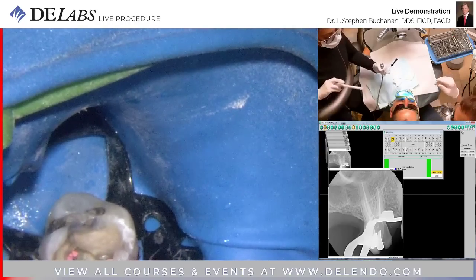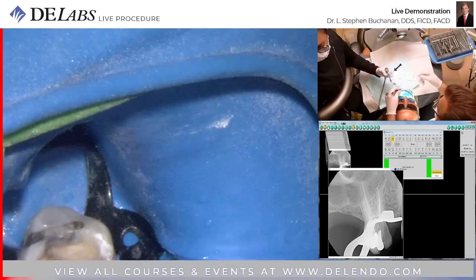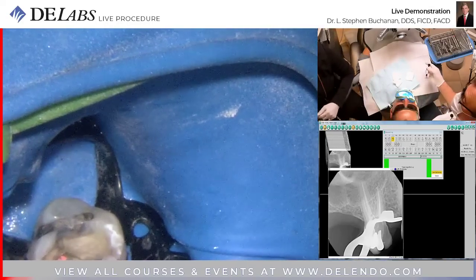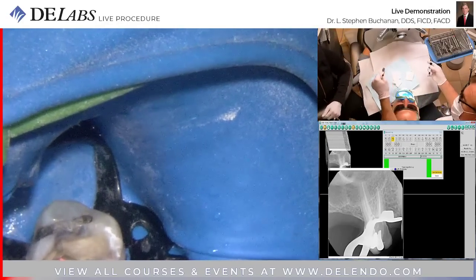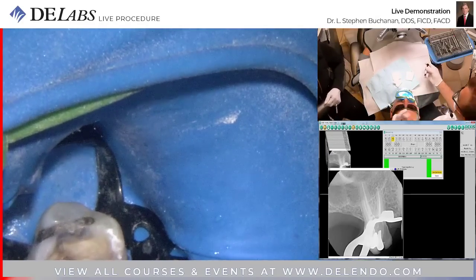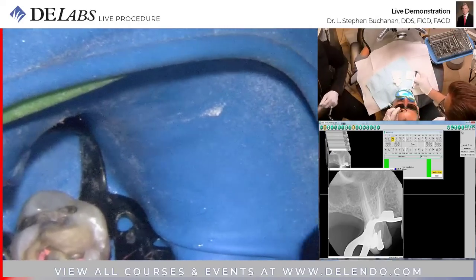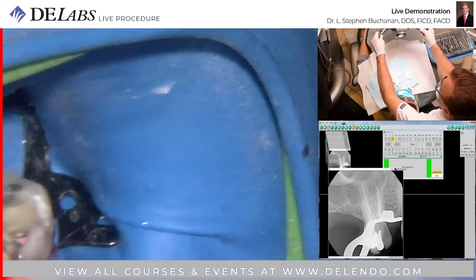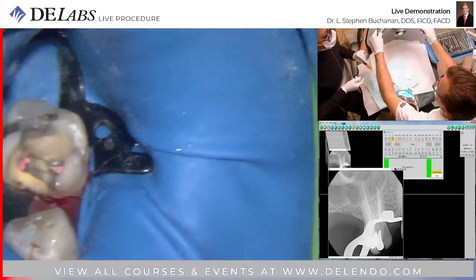I would say about 25% of the cases we do the buildup. If the doctor wanted a post space, sure, I just don't backfill. I'm going to down pack to mid-root, separate, pull out the gutta percha alongside the electric heat plug or condense down there. All you have to do is put a, let's see. Yeah.